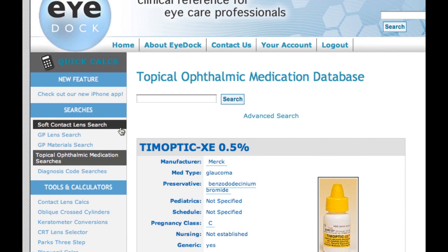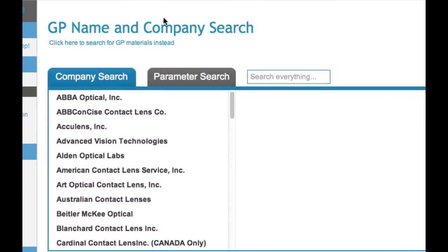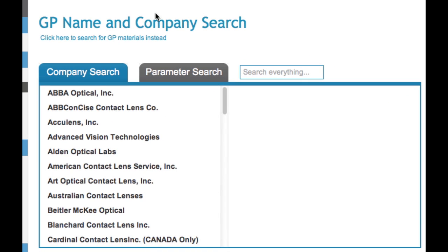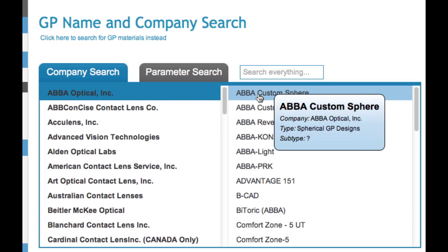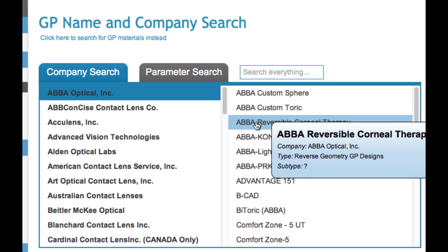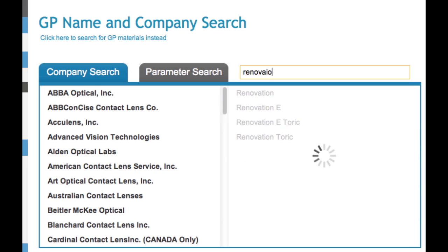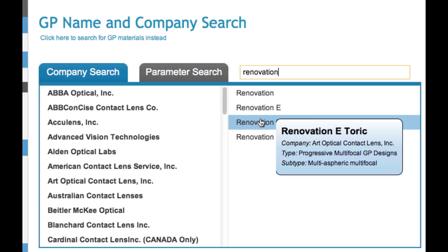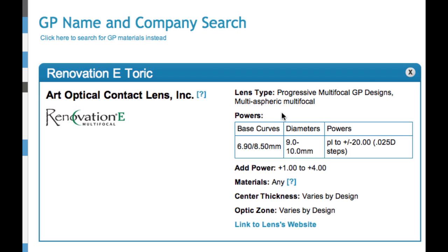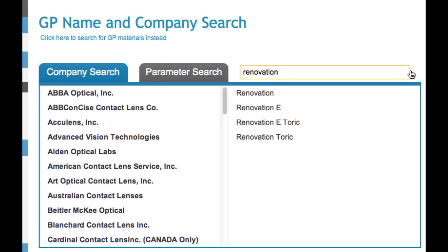Let's go to one of the newest features — the GP lens searches. Here you can search by lab, so you can look at all the lenses from ABBA Optical, and if you hover over each one, you'll get a little bit more information about the company and what type of lens it is. You can search by name — so if I type in "renovation", you can find all the lenses with that word in it. Clicking on one takes you to that listing. There's quite a variation in how much information we have about particular lenses. As you know, GP lenses are oftentimes made to order, so for a lot of them we don't list as specific parameters as we do for some of the soft lenses.